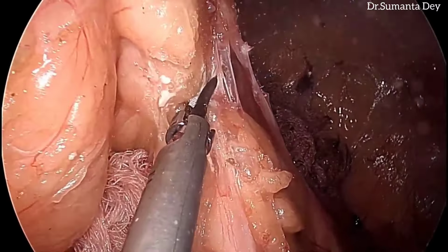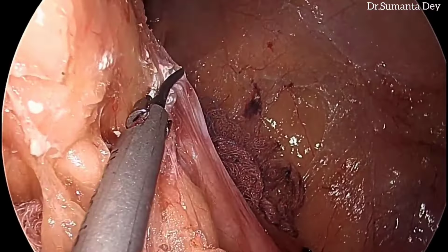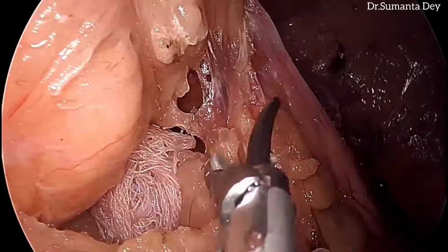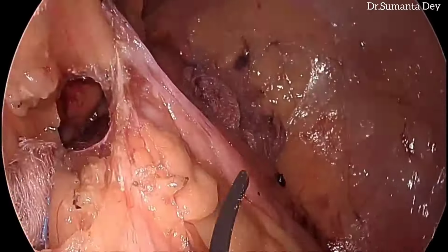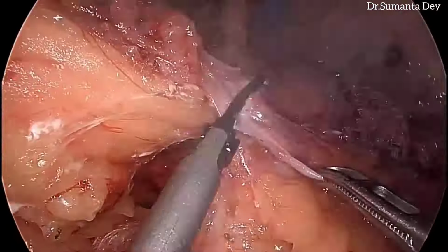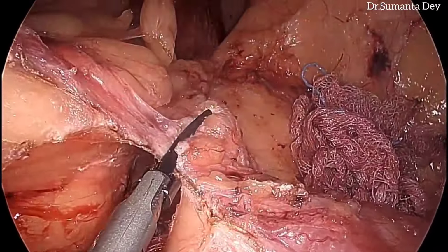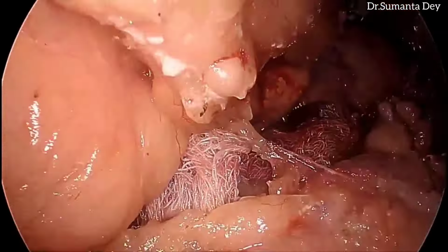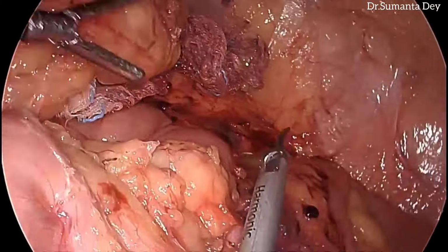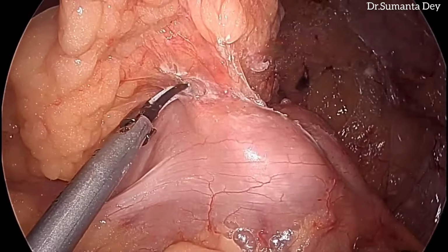The only part left is a few attachments of the splenic flexure with the greater omentum, and using harmonic shears I am dividing it, and once it is divided, the complete mobilization of the splenic flexure is done. So this is the most important part of this operation, probably left hemicolectomy or segmental colectomy, where you need to mobilize the splenic flexure. If you follow the correct oncological principles and follow the proper anatomical planes, you will be able to mobilize the complete splenic flexure.